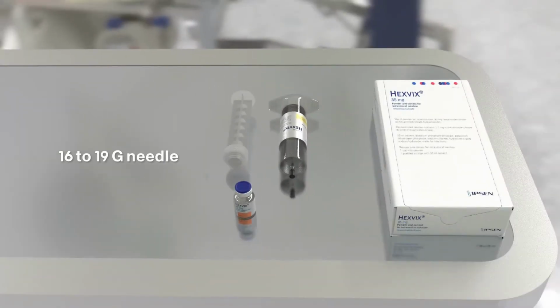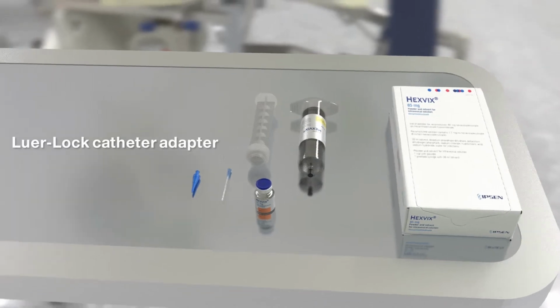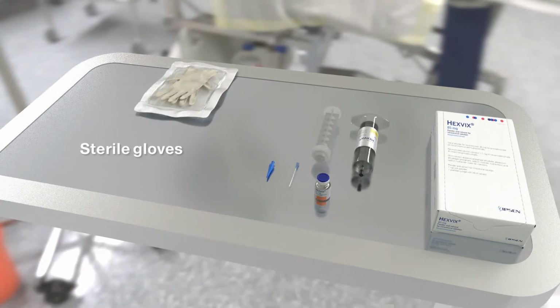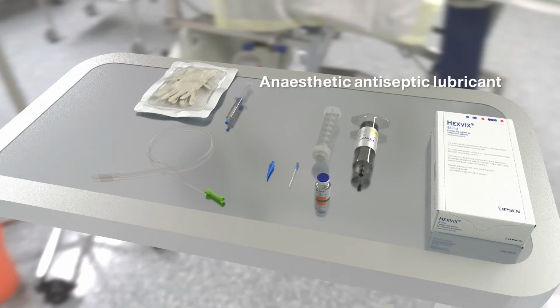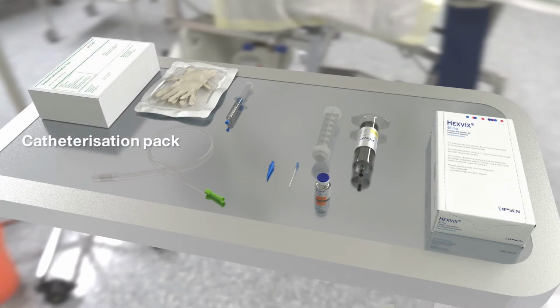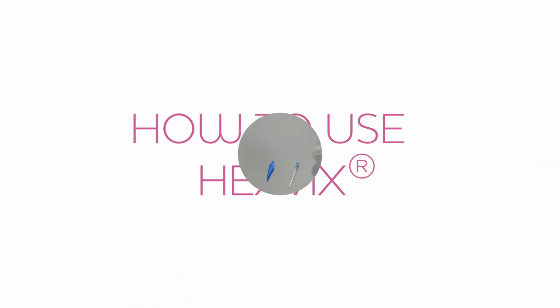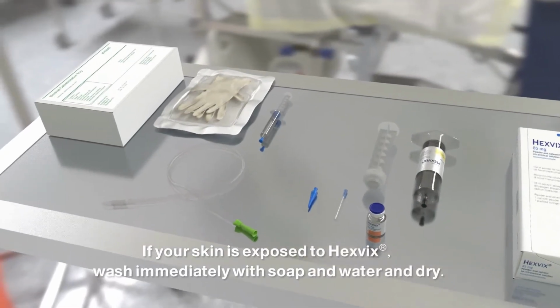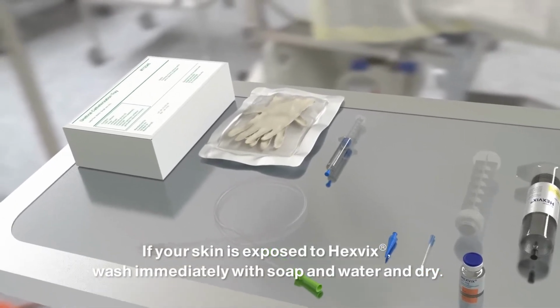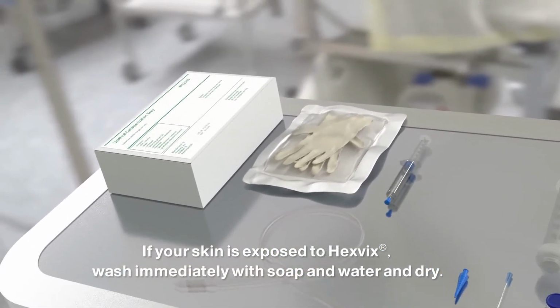You will also need a large gauge needle, a Luer-Lock catheter adapter, at least one pair of sterile gloves, a disposable straight or intermittent urethral catheter with a proximal funnel opening, an anesthetic antiseptic lubricant, and a sterile catheterization pack. Wear clean gloves for the preparation, and the sterile gloves from the catheterization pack later on for the catheterization.